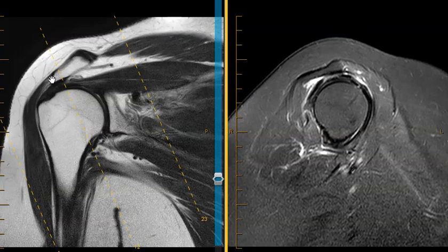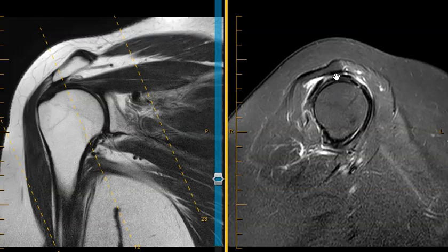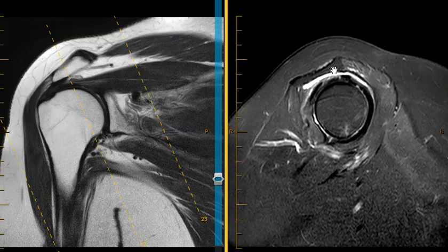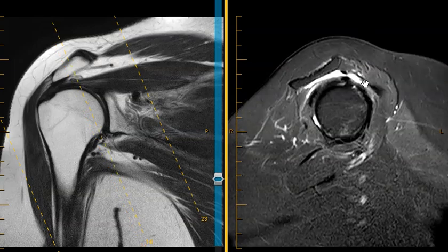So you have two things: inferior lateral acromion tilt and a positive acromion slope. You can see how it's pushing on the rotator cuff. This dark band is the rotator cuff going over the humeral head. Here's bone, here's bone, and here's the soft rotator cuff tendon complex. Right here you can see how it's flattened, compressed, and pinched. So this looks like this patient has probably chronic impingement, which is really a clinical term. And there's white here — this is that fluid, or bursitis — evidence of acute bursitis.